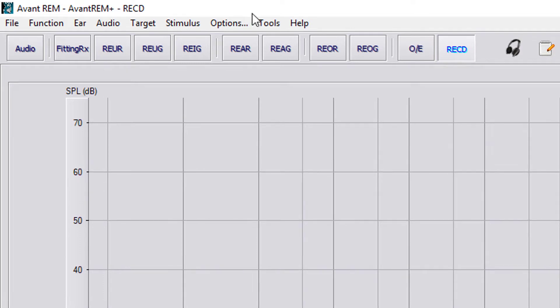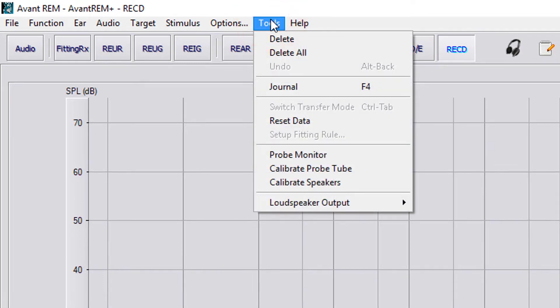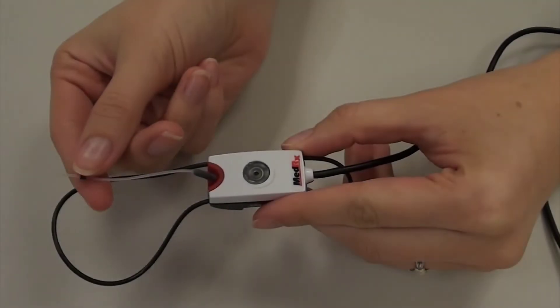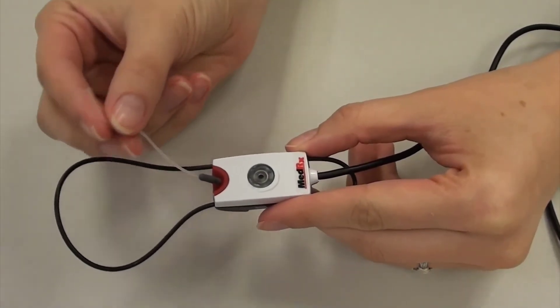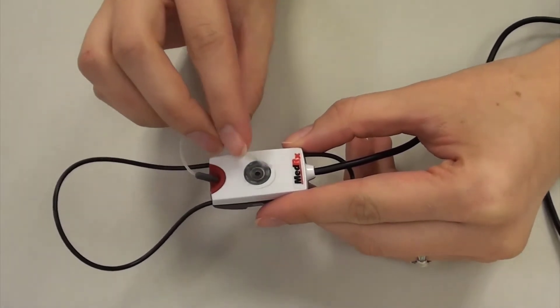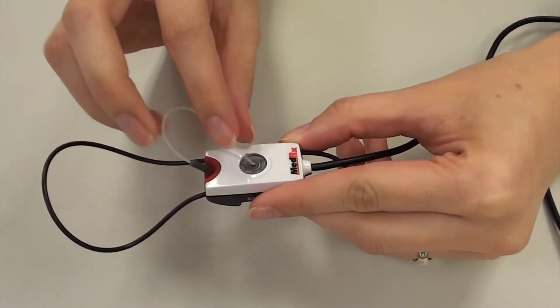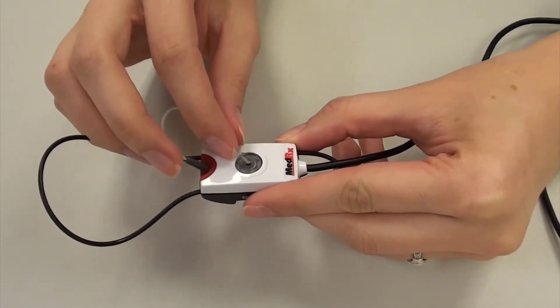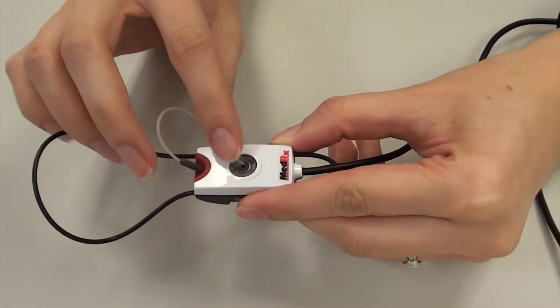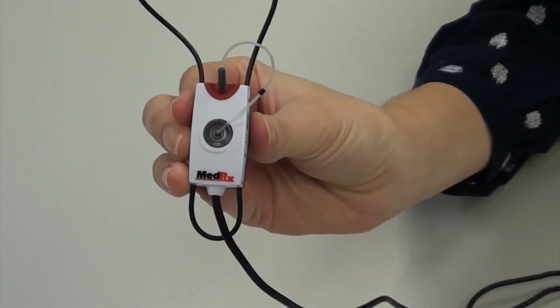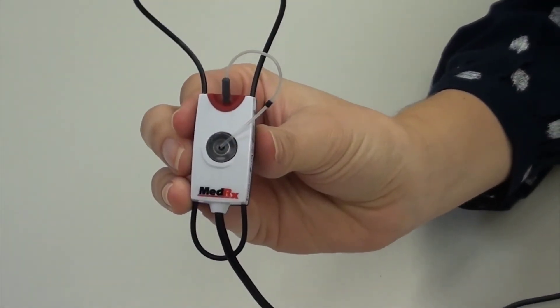To calibrate the probe tube, go to Tools in the top toolbar and select Calibrate Probe Tube. Place the tube in the V-notch, which is located on the illuminated portion of the probe microphone. This V-notch will hold the tube in place for calibration. The tip of the tube should be lying directly over the top of the reference microphone in the center.